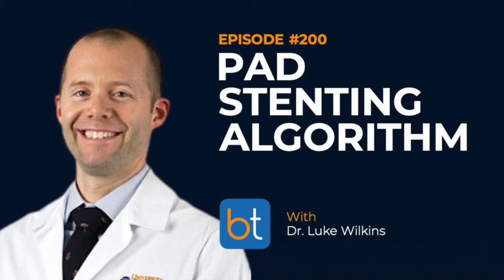I use the Outback device probably most frequently. That is a sharp reentry cannula. It has L and T markers on it that help you orient within the subintimal plane to direct you towards the true lumen. It is best used in cases when you know exactly where the true lumen is with respect to the device. So usually vessels that are more heavily calcified and allow you to see exactly where you're driving your sharp reentry cannula. Those are the best cases to use the Outback device.